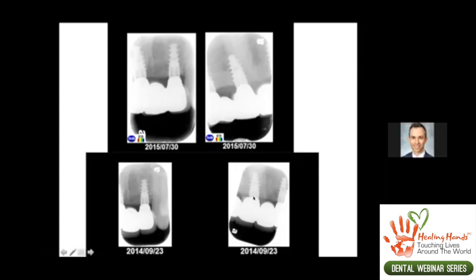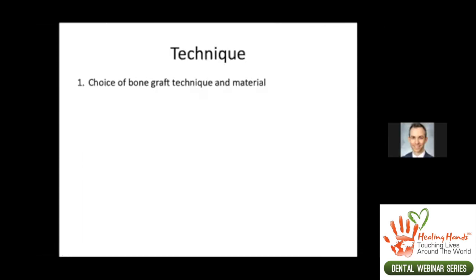Look at this restoration. It's a screw-retained restoration that's directly at the implant platform level, so there's no room for a restorative abutment. And you can see the emergence of this central incisor crown from the implant is quite poor. It's boxy. There's not enough room for emergence. So if I can criticize myself, I should have placed these implants more apically in a vertical sense to allow more room for emergence here. But thankfully, he's maintaining this with good crestal bone height, and the prosthodontist was able to make it work.